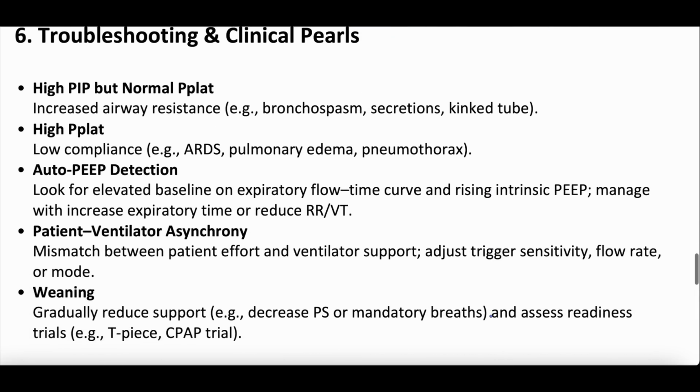Troubleshooting and clinical pearls. I'm going to leave this here in case you want to look at it. This is a little outside of this video, but I wanted to include it here because it helps you understand kind of plateau pressures, PEEPs, auto PEEPs, ventilator desynchrony, how to wean, which are all separate episodes. But for the sake of comprehension, it's here if you want to pause and take a look at it.